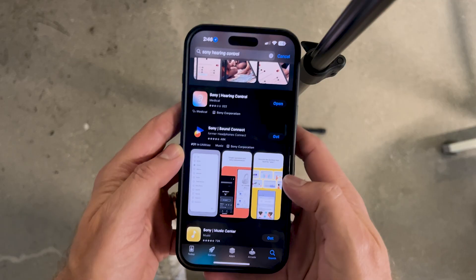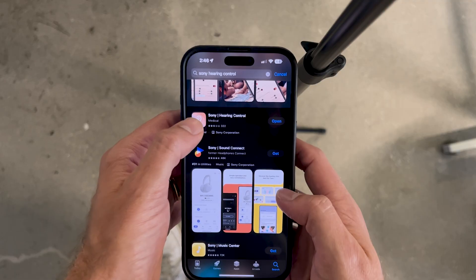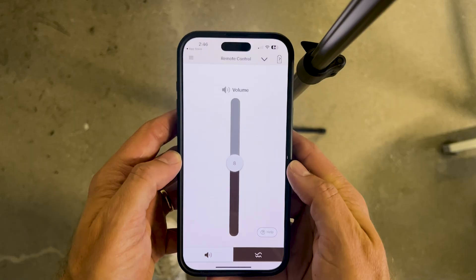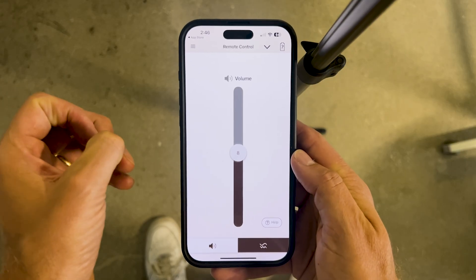If you've just purchased a pair of Sony hearing aids, you'll want to charge up your devices before getting into the setup process. I've charged these up overnight. I'm going to pull them out, put them in my ears, and we're going to start walking through the app process. Once you have the Sony hearing aids in hand, the first thing to do is search "Sony Hearing Control" in your app store. You'll see an app that looks like this — download and open that app.